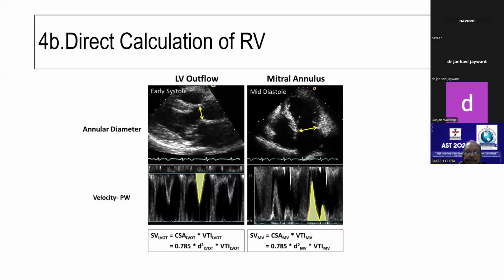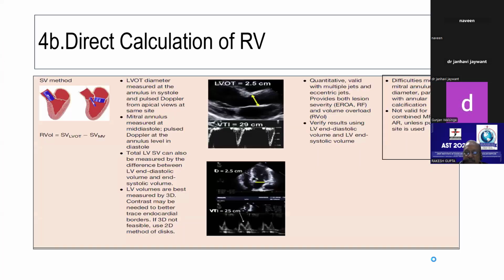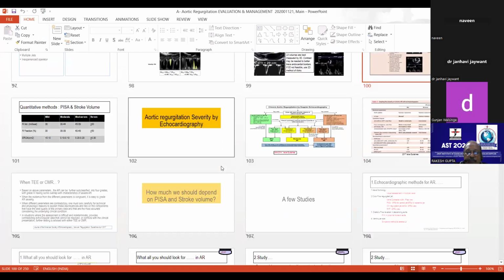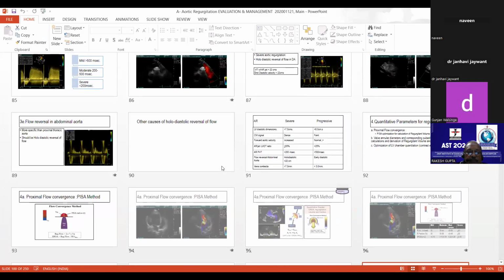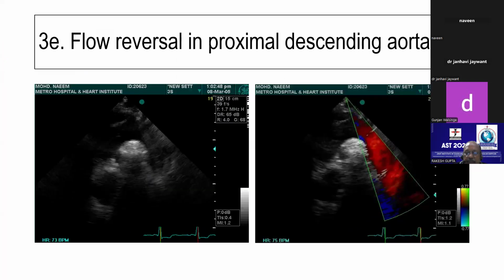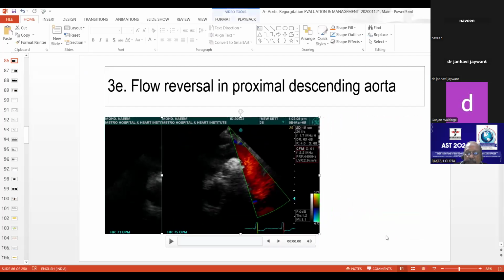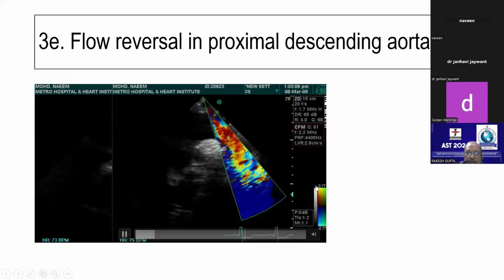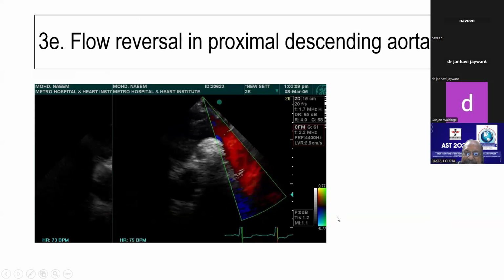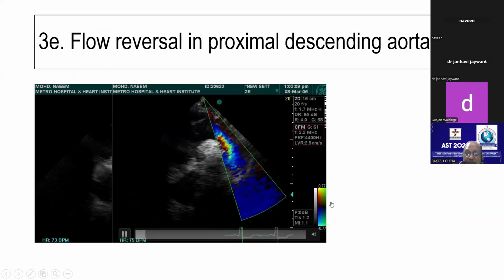A minute. The previous video before the holodiastolic, the scale had the green. Just a minute, give me a second, I'll come down to that. You mean to say this scale? Yes, sir. This is known as a variance map. In this variance map the colors are changing on this scale also.